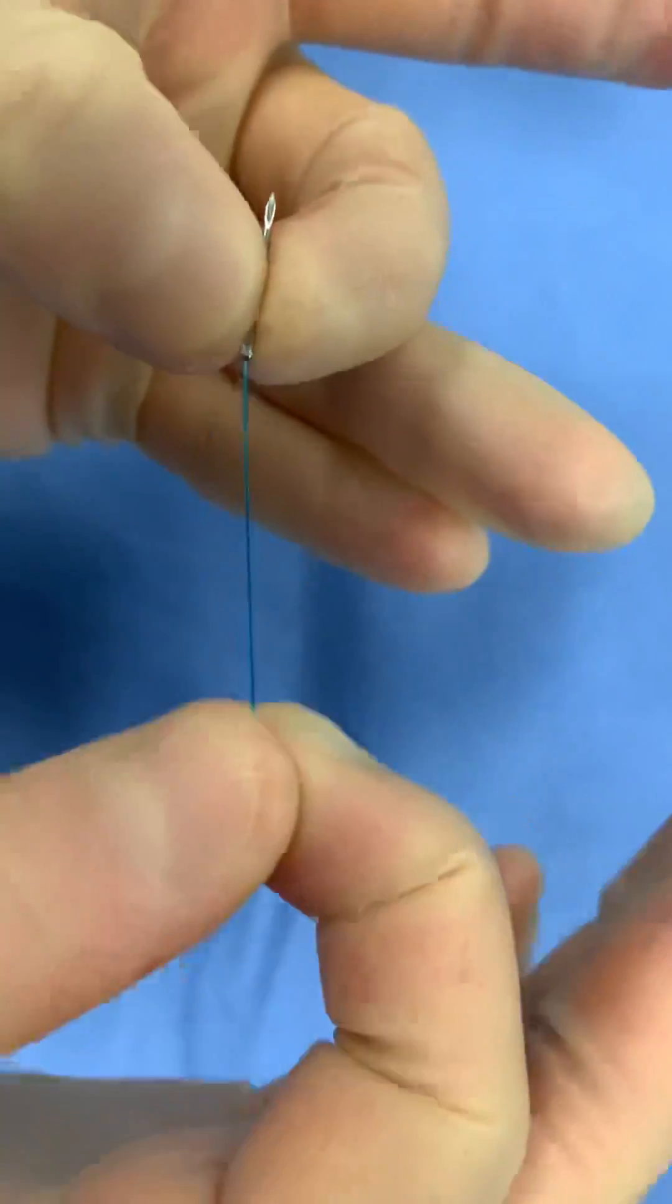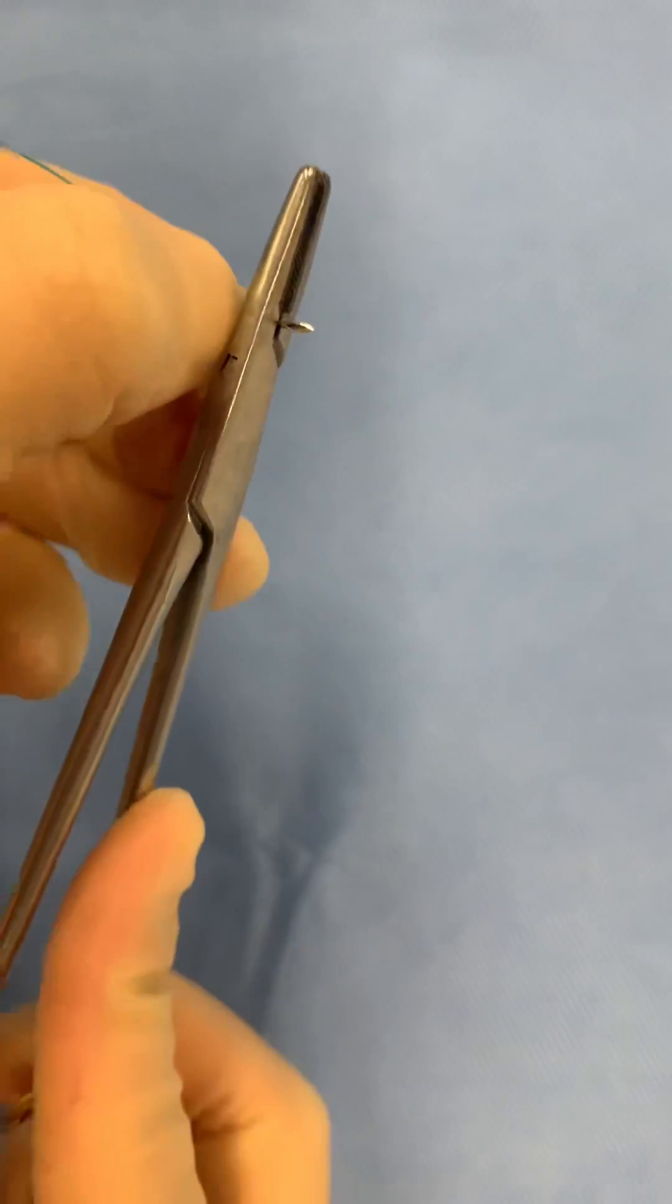Perform a tug test to ensure the thread cannot be pulled out. Then very carefully, bend the needle into a half circle.